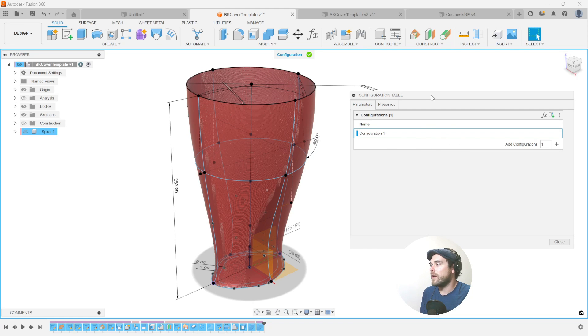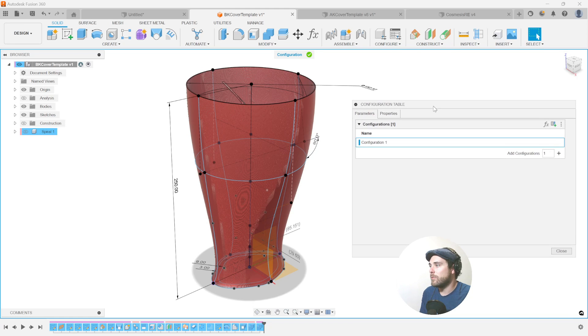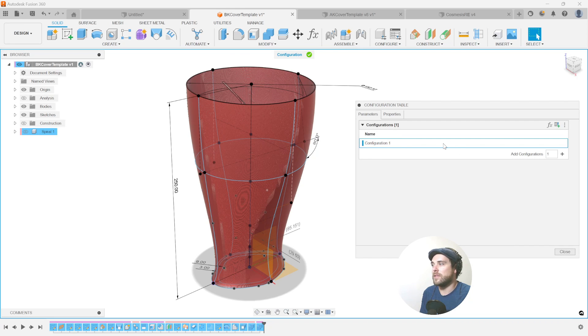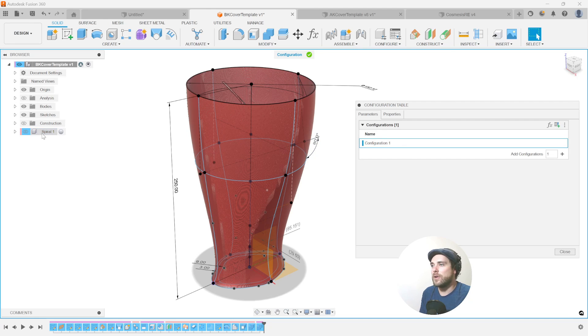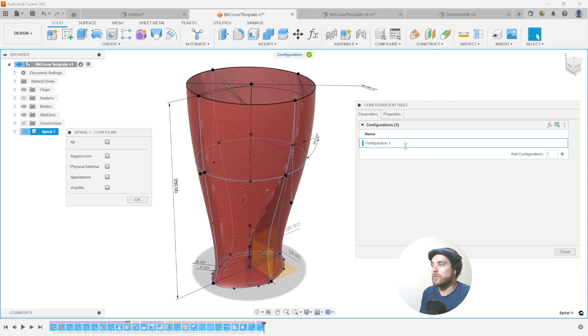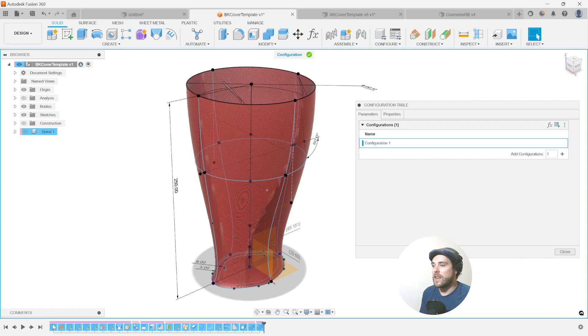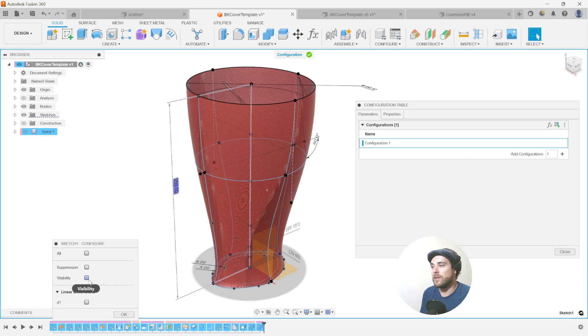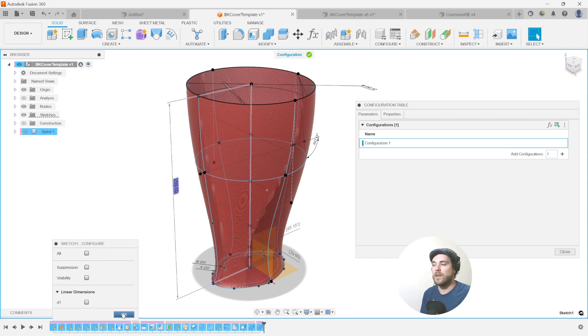but essentially a configuration table is now available and it's highlighting in blue all the different things that we can affect with this configuration and you can affect almost anything. If I go and click on this, I can see that I can affect the suppression, the physical material, the appearance, or the visibility of this component as a variable in my first configuration. If we go into any of these features here, Sketch1, you notice Sketch1 has the linear dimension D1. It also has suppression and visibility. I can toggle all of these things off between configurations, which makes it really interesting.